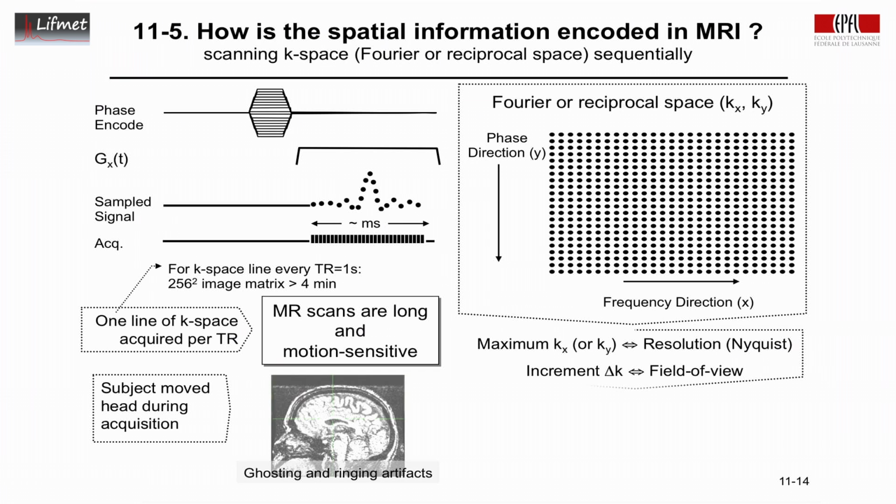So in this whole process, since what is being acquired is the Fourier transform of the object, the image reconstruction has no influence on the resolution. The resolution is uniform across the entire image, and also the sensitivity as such: once the signal is acquired, the reconstruction process induces a uniform sensitivity.